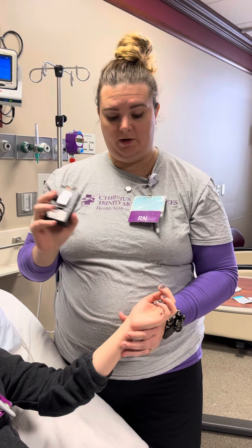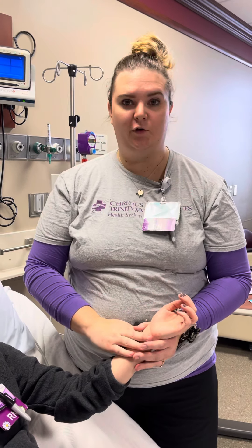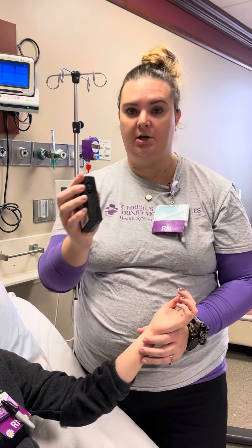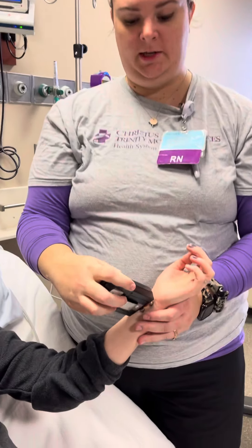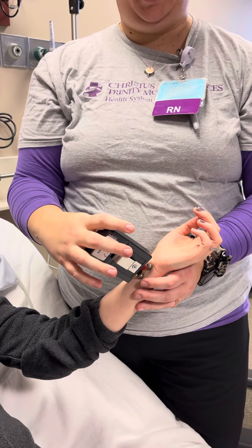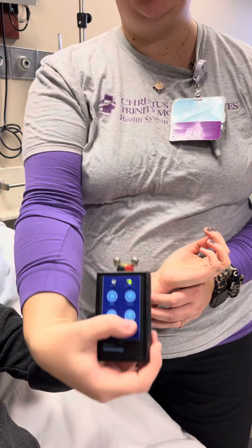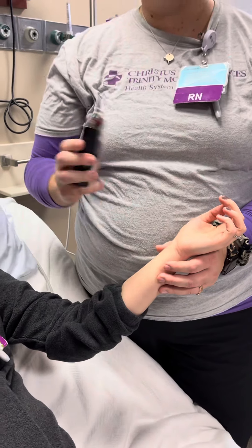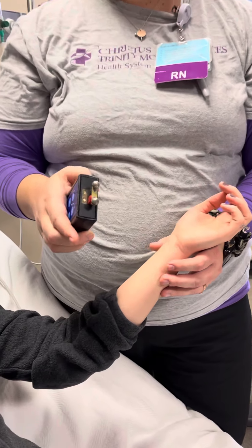We're going to start with Casey here. You will start at the lowest amp, which on a train of four is one, and you will hit the train of four button and look for four twitches. Since I already know what Casey's baseline is I'm going to go ahead and go up to her baseline, which is six.